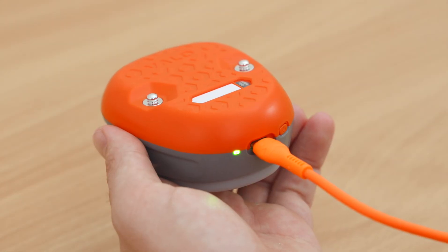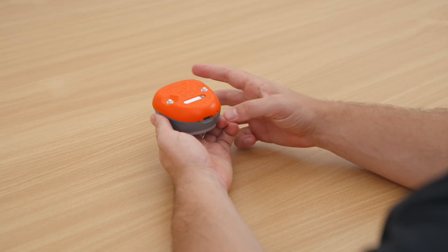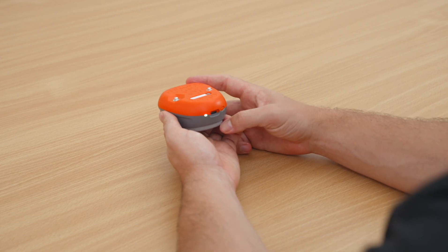The LED display will flash green when it's ready to go. Turn the Dynamo Lite on by pressing the power button until the display light powers up.